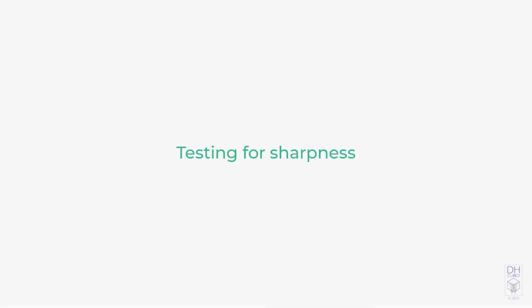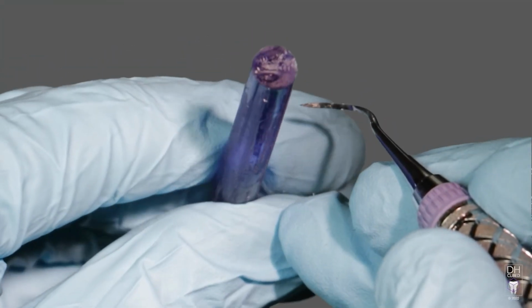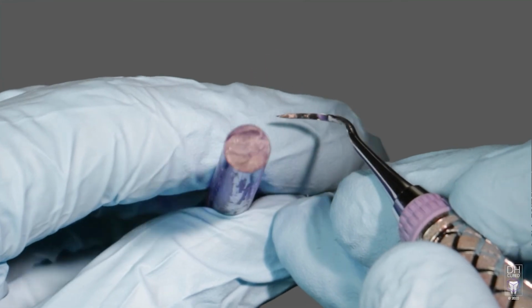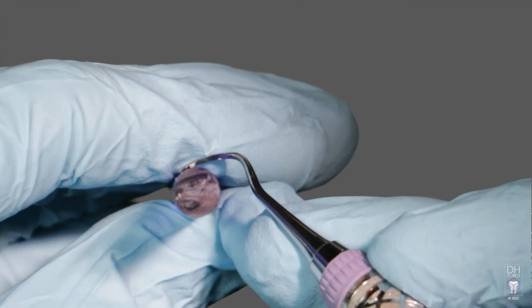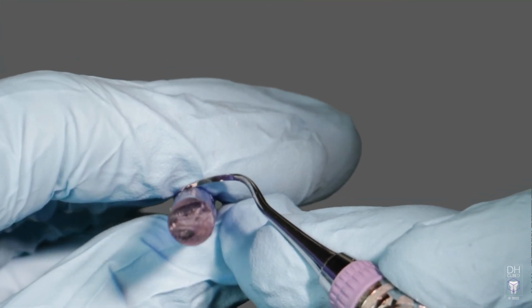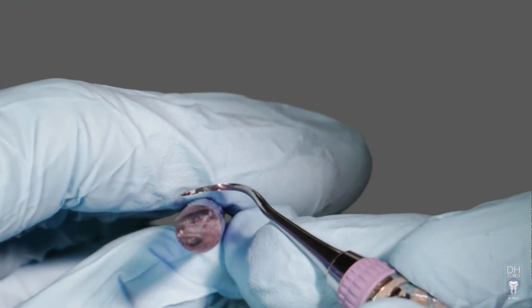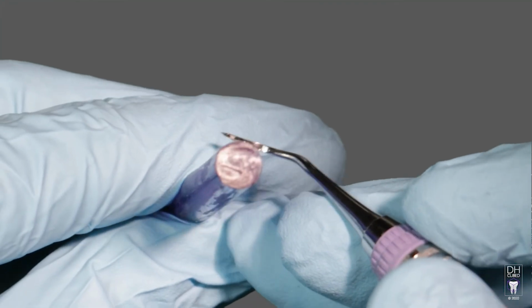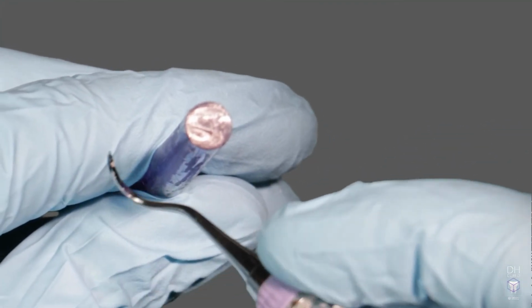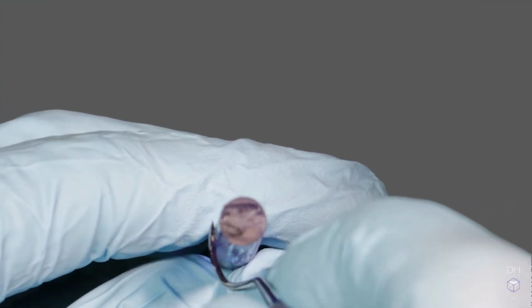Testing for sharpness. Before you test for sharpness, you first want to orient your test stick properly. Hold the test stick so it is shifted towards your body at an angle where you can see the face of the instrument being adapted at the working stroke angle of 70 degrees. For the other end of the instrument, again, hold the test stick so you can see the face of the instrument. This will require you to shift the stick away from your body so you can look directly down on the face. You want to see the face of the instrument at all times.